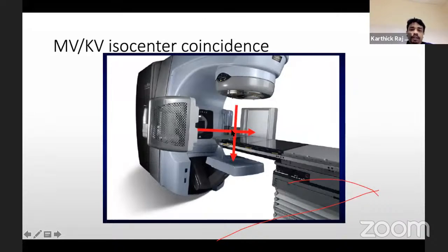So when I match a patient's DRR with the taken image and get an error of 2 millimeters, you have to keep an action level. If the difference is 2 millimeters, I will not apply any correction because my imager resolution is 2 millimeters. Anything more than 2 millimeters, then I will do the correction. If my error is minus 2 millimeters and I try to correct for 2 millimeters, sometimes I go in the opposite direction and end up at minus 4 millimeters. This is why we need to keep an action level. This is a typical example of why you need an action level in a radiotherapy setup. If I know the accuracy of my imager is within plus or minus 2 millimeters, you have to tell your technologist: anything less than 2 millimeters that you find in the DRR and taken image match, don't try to do any correction. You are going to overcorrect the patient. That is your tolerance level.